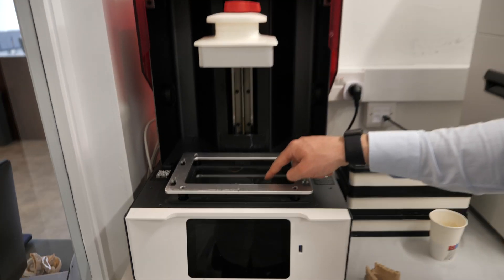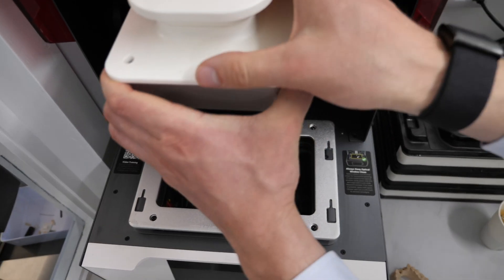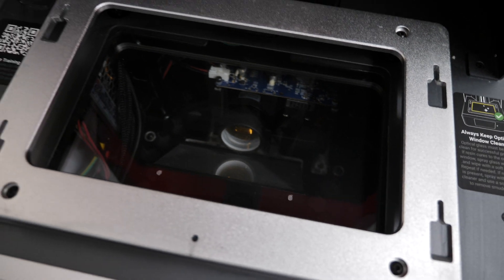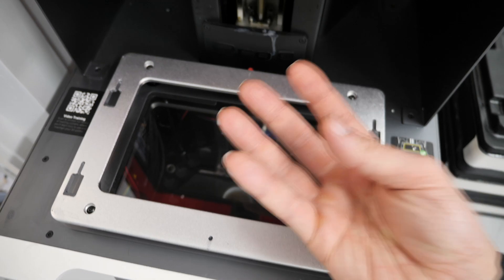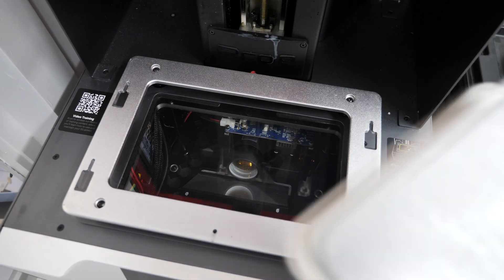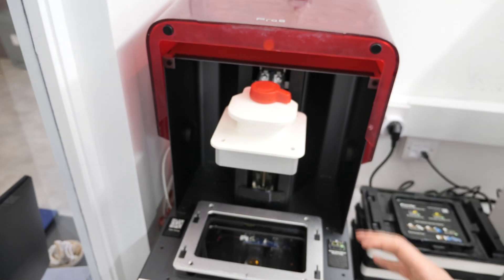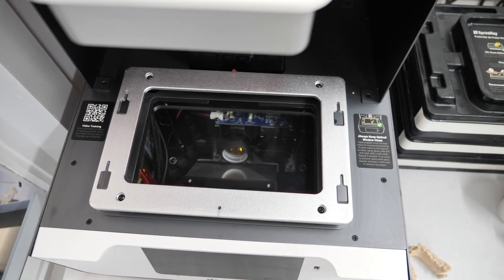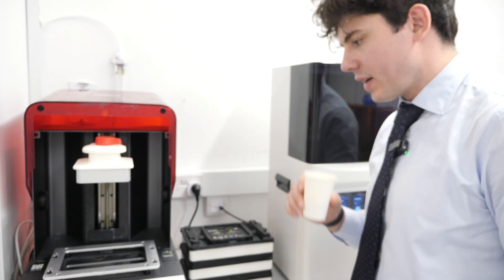It's a DLP printer — digital light processing — which uses tiny mirrors to reflect light. If you look down into the optical panel you can actually see the light processor. It shoots light reflected off a mirror panel which comes up and cures the resin, which in turn sticks to the build plate. DLP means it's fast. The old SLA laser printers were slow because they could only cure one surface area at a time.